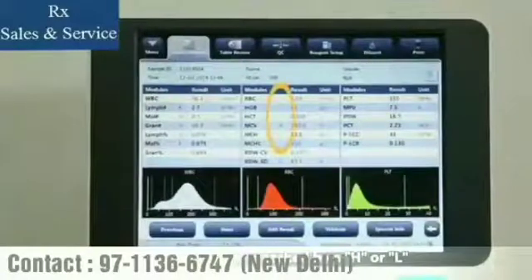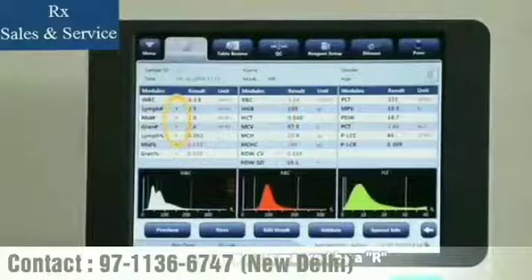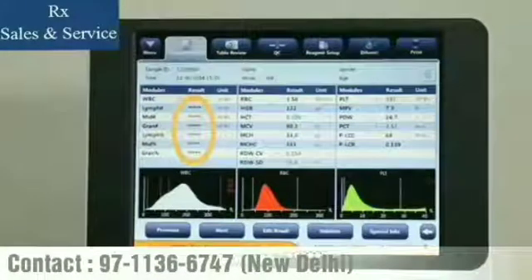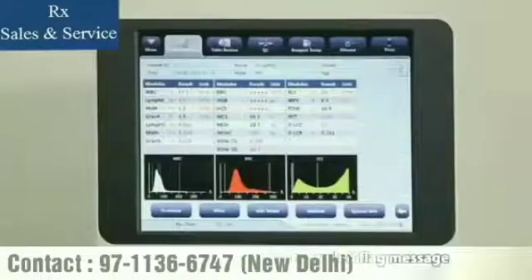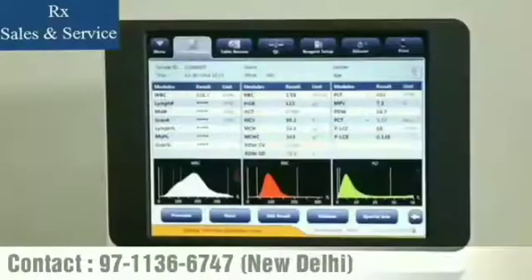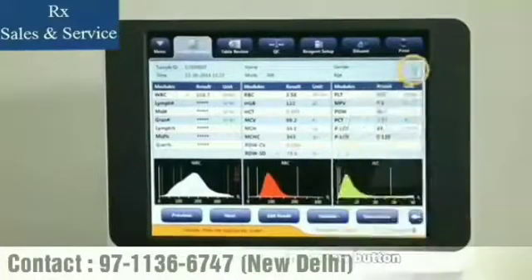If a parameter is marked by an H or L, it means the analysis result exceeds either the upper or lower limit of the reference range. If the parameter is marked by an R, the result is questionable. Five asterisks opposite a result means the result is invalid. Two kinds of flag information can be provided: detailed flag messages and traditional markings on histograms. Flag messages can be hidden or shown by tapping the arrow button.